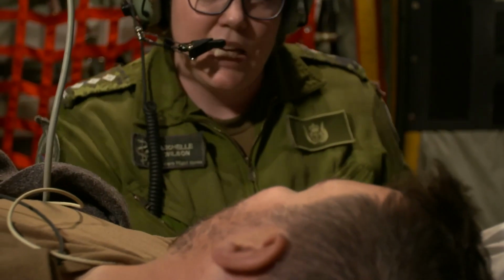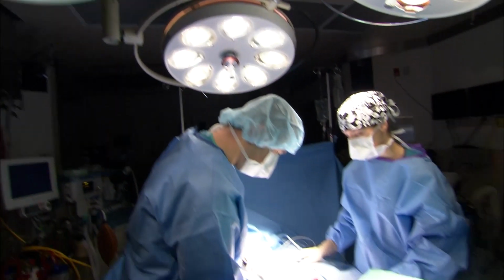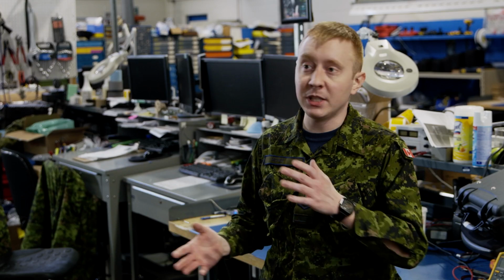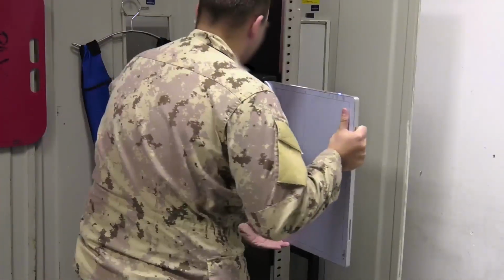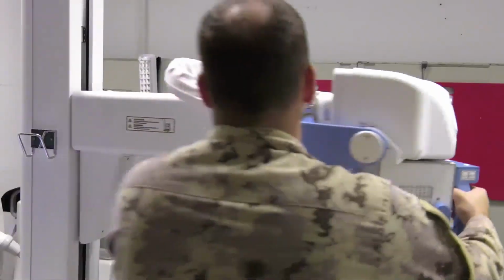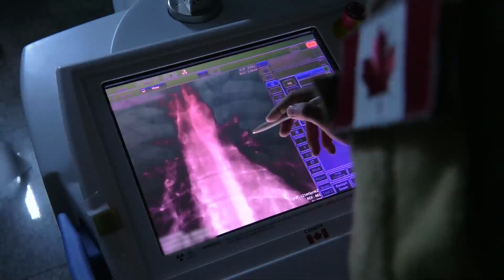One of the most important things in a hospital, especially if you're running a field hospital, is ensuring that the most mission-critical kit that you have the fewest of is repaired. So you might have a Propac MD patient monitor, and we have about 10 of those in the hospital, but we only have 1 oxygen concentrator, we only have 1 or 2 x-ray machines. So if the x-ray machines go down, that's not something you can just simply swap out and put another one in place. We've only got 1, and when it's needed, it's absolutely needed at that time.